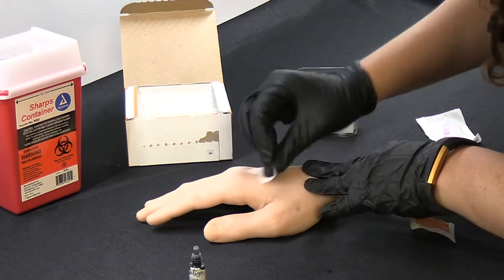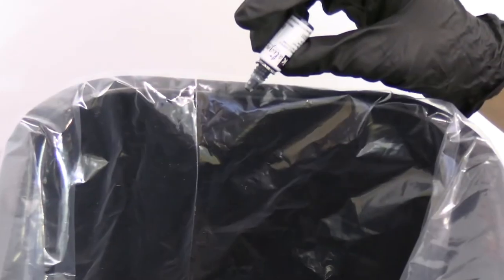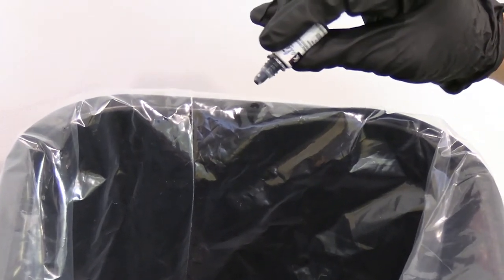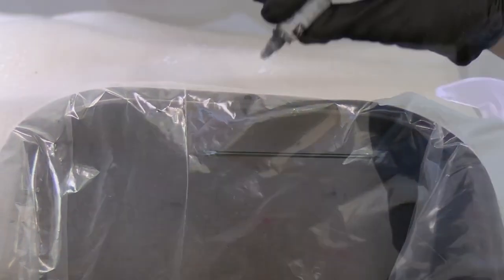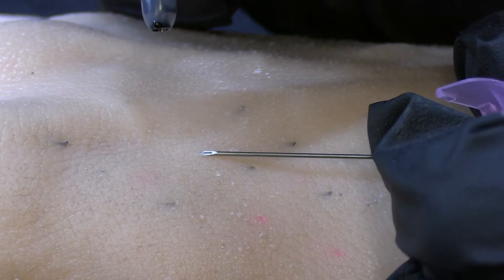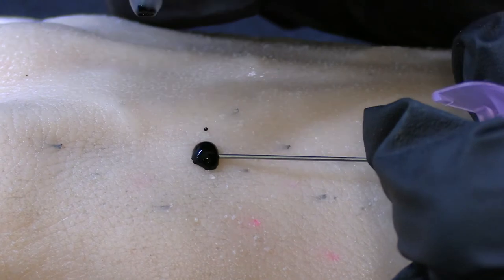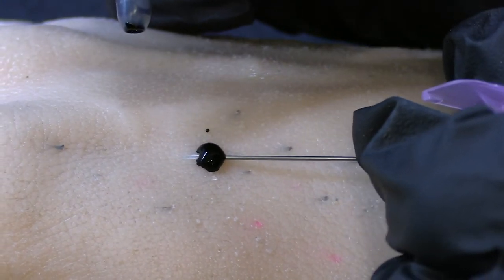Make sure the surface of the patient's skin is clean and sterile. Hold the Incoline dropper between your thumb and index finger over a trash receptacle and squeeze to produce ink drops. Gently insert the desired needle point under the skin surface. Carefully squeeze the dropper, dropping ink into the needle tip. Twist the needle and remove.